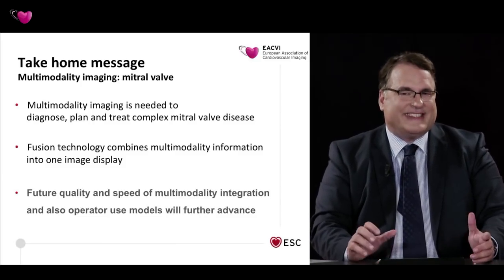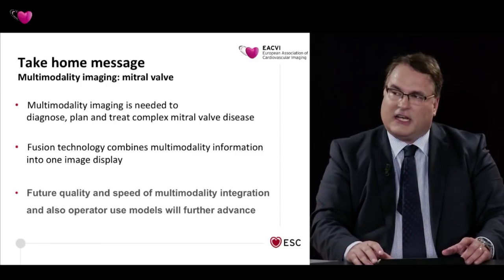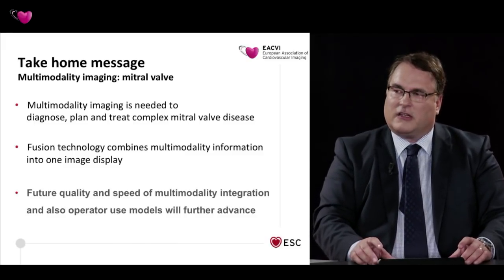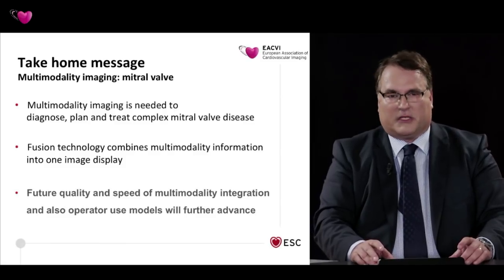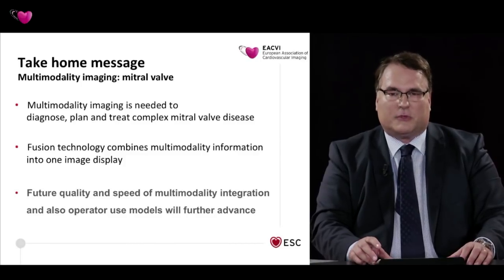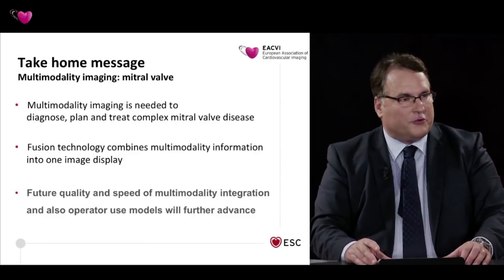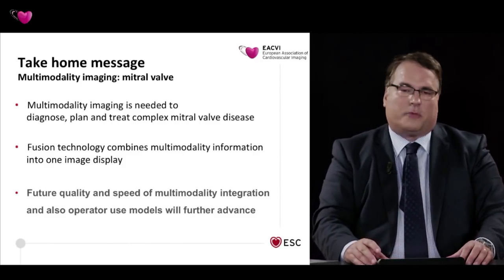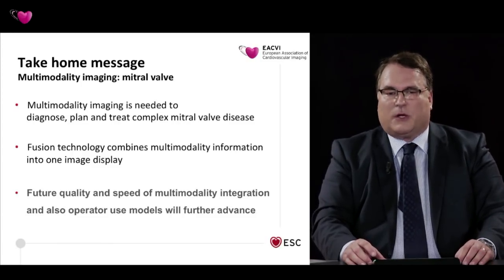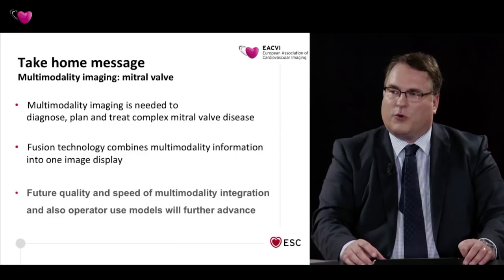Multimodality imaging, I think, is needed to diagnose, plan, and treat complex mitral valve disease, and I think all 3 cases and also the 4th example were very well suited to show these arguments. Fusion technologies, and we spoke about the limits but also the advantages, combine multimodality information into one image display. And this display, of course, also can get better in the future. And perhaps it's a helmet with which we are operating in the future. So future quality and speed of multimodality integration, as well as the operator use models or skills, will further advance as we use this technique more and more.